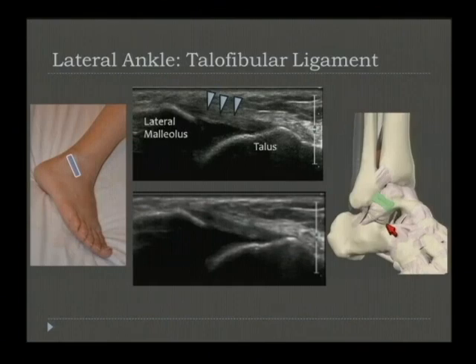This happens to be the weakest of the ligaments along the lateral collateral ligament complex and is the one that is most commonly injured. Here, in order to evaluate this and place stress on it, you will put the foot in plantar flexion, inversion, and often have to put the foot off to the side of the bed. You can then pull on the toes anteriorly. This is called an anterior drawer test, similar to what you would do in the knee.